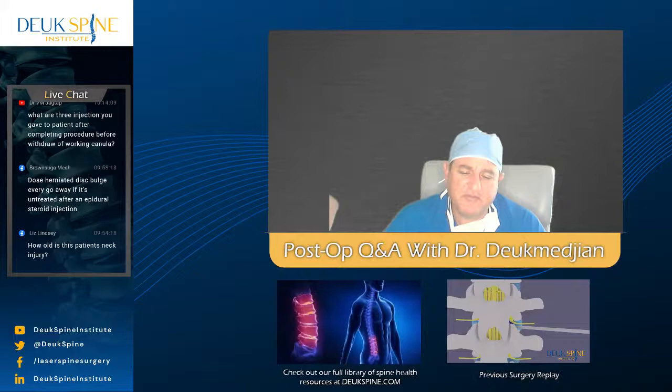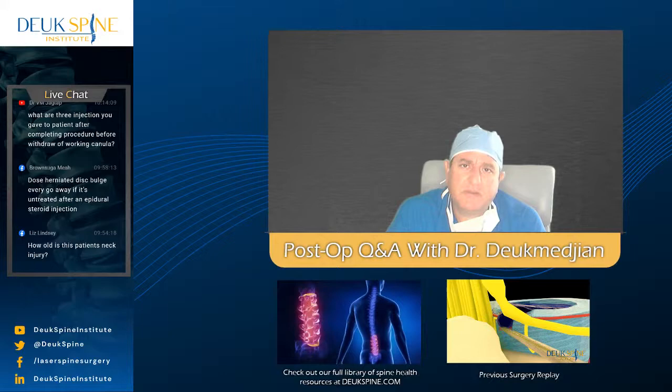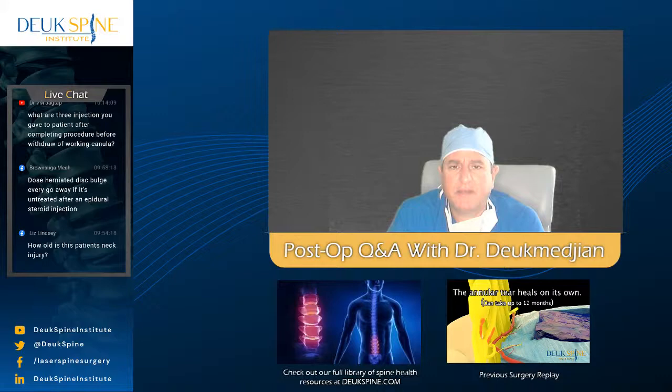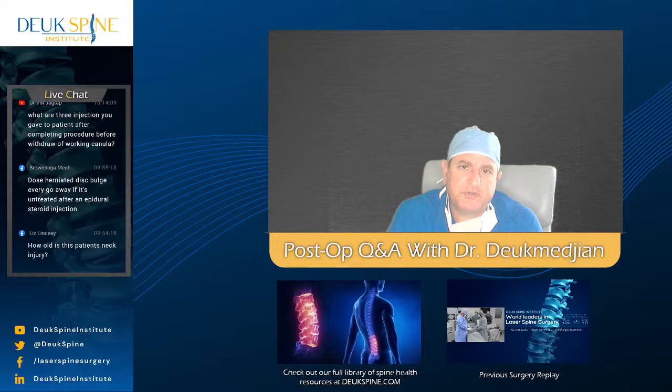So the first injection we do is an antiseptic, and that is something called betadine. Betadine was developed right here at NASA. We're literally 10 minutes from NASA. We're located in the Space Coast of Florida near Orlando. And betadine is just a great universal antiseptic, topical. You don't drink it, you don't inject it, you basically just let it go into the surgical wound, and then you irrigate it out. So injection number 1, betadine.